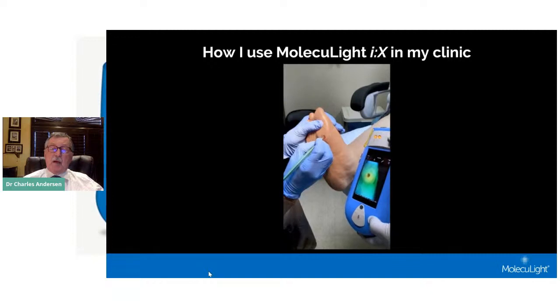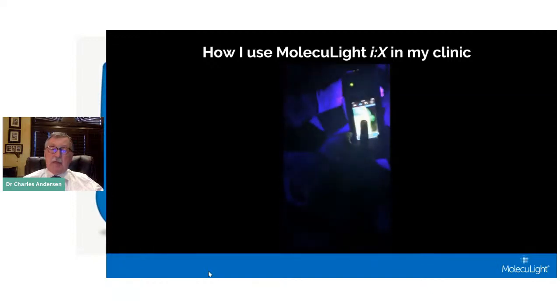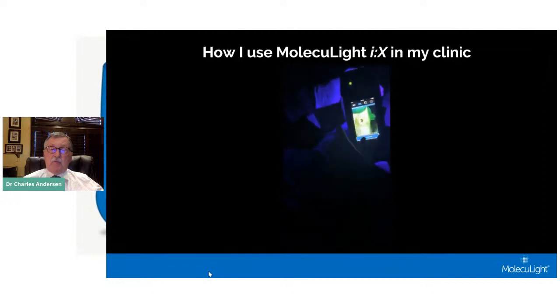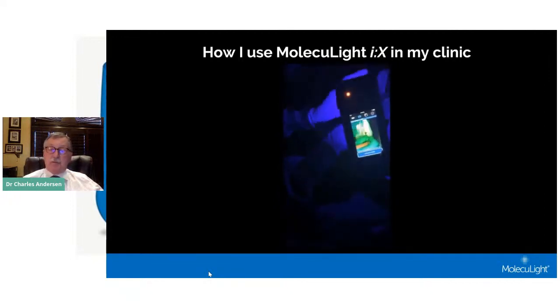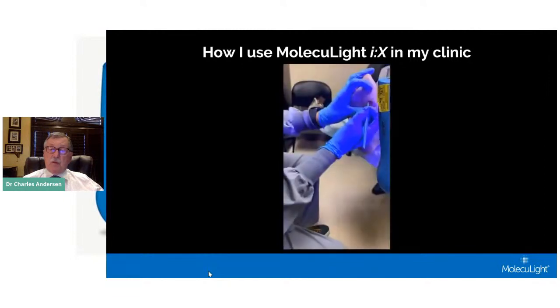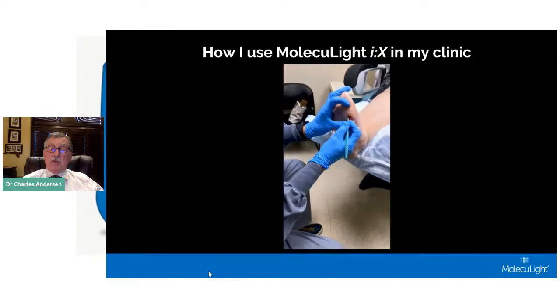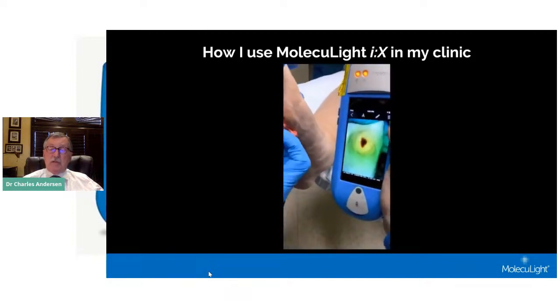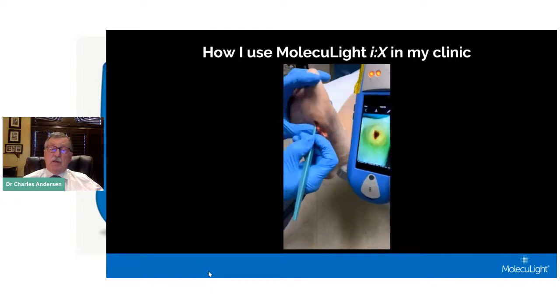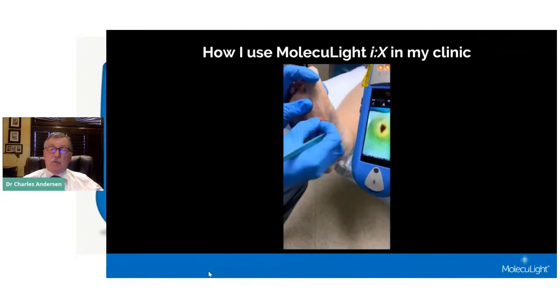What I'm doing now is using that information that we've obtained with the scan, and I'm performing a curette type of debridement. Once we have finished that debridement, we can then rescan the wound to see if we've removed the fluorescence or the bacteria around the wound.